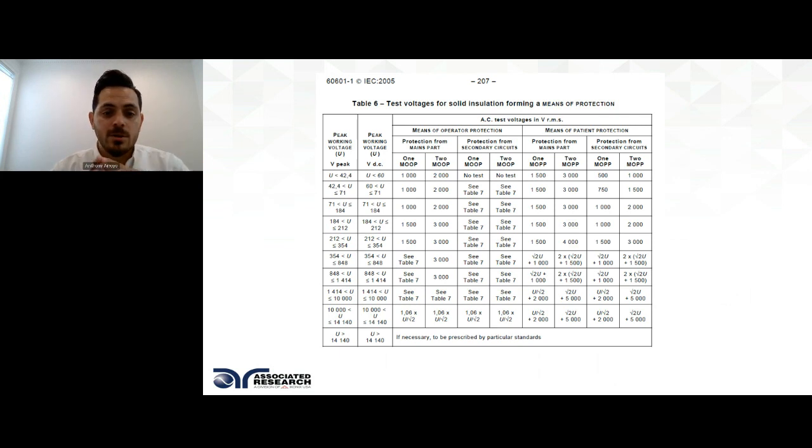And so it's important, especially for our reps. A lot of them will email you and say, what test voltage should I use? What high limit do I use? We can give them recommendations on what we understand is industry standards or industry norms, but the responsibility is on them to find out what standard they are testing to. You need to identify what test voltage you'll need, what type of current you'll need, so that we can diagnose the correct unit for them.